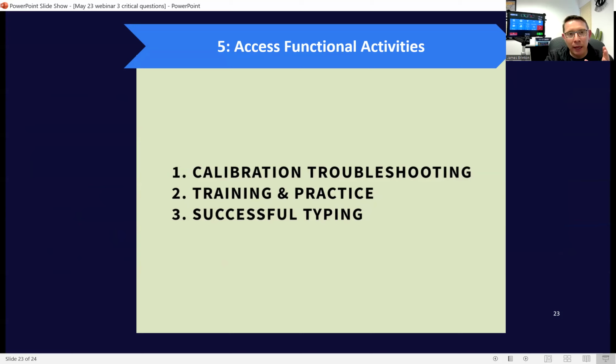What we did is we led them through the process of answering these 3 questions, tweaking our software to accommodate for their eye conditions. So we have somebody with very thick glasses. We also have somebody with nystagmus. We led them through calibration, modified the screens, and answered these 3 questions to get them to the point where they could be typing and speaking using the Eyegaze Edge, as you'll see here.